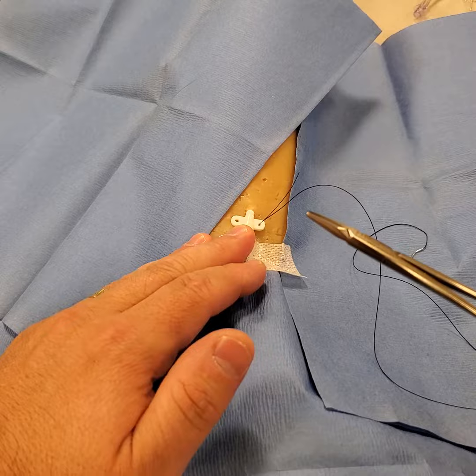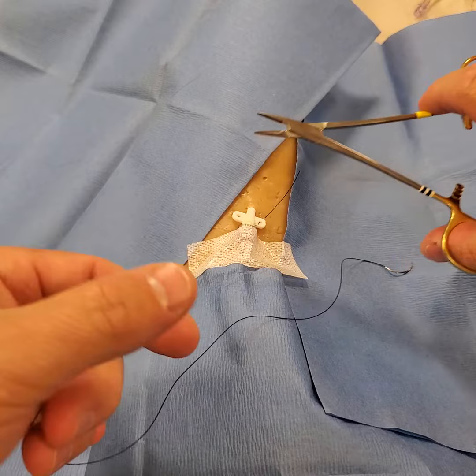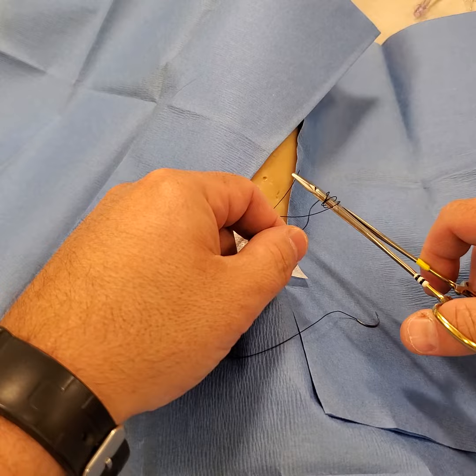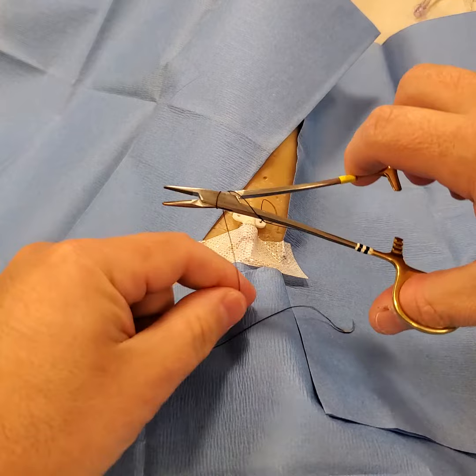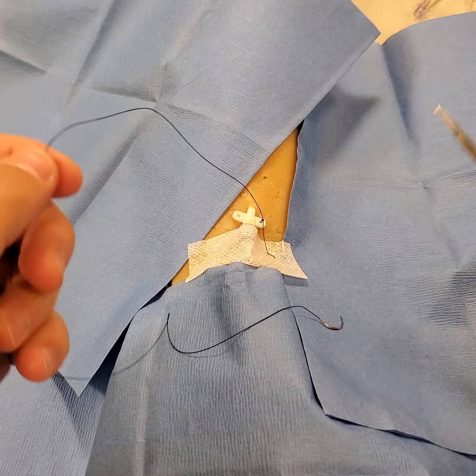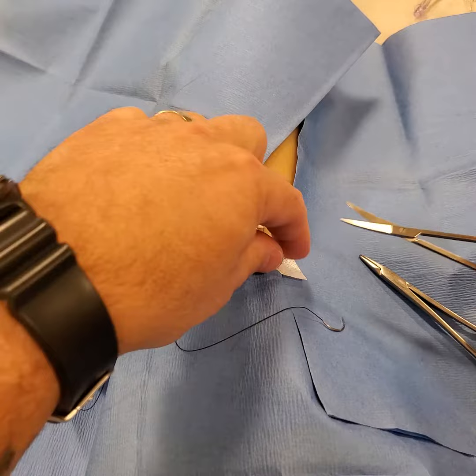Have your needle drivers open. As long as you have three knots in a descending fashion — I'll do a three, two, and one. So one, two, three. Grab the end, pull it taut. One, two — grab the end, pull it taut. One, grab the end, pull it taut. You can have four knots or five knots, it doesn't matter, it just makes the knot bigger. Three is the minimum.